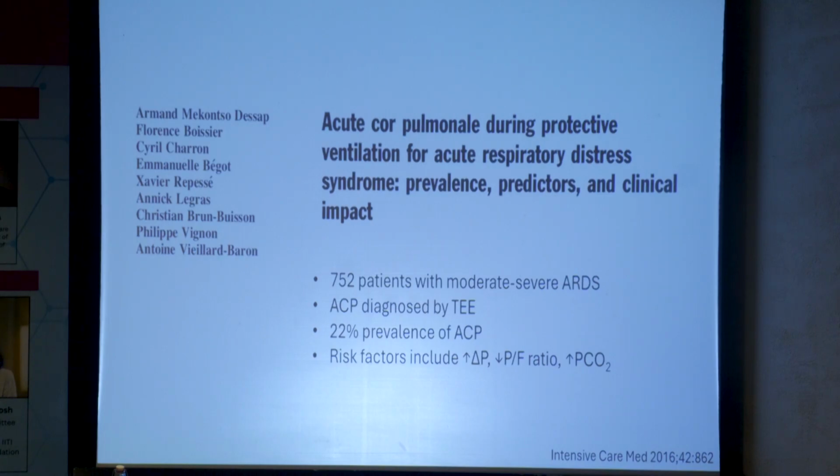And we use this when we are faced with the situation that you try anticoagulation, the patient bleeds, we stop the anticoagulation, then we try again, bleed, and we say, okay, we're not going to use it. So what we will do is keep the flow high and cut off the sweep as a trial run rather than fiddle around with the flow. So we keep the flow on the higher side, but we cut off the sweep, and that's another way to test for it. Having continuous high flow through the cannulas is a pretty good method of keeping them patent.